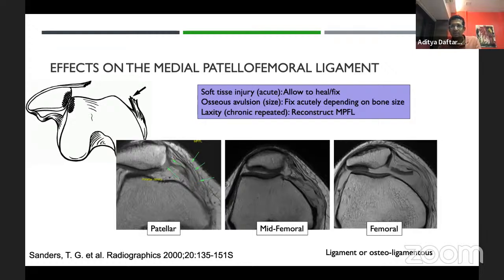In that case, you asked me about the quality of the tissue. I can give you something. But even if it's robust quality, if the person is dislocating repeatedly, you are going to reinforce it. So I don't even understand the entirety of this thing. The reason that I could give you that would be useful to understand about the MPFL is if I tell you that there's a bony avulsion that is sizable. Then I can tell you that, okay, this is the size of the avulsion. You can fix bone back rather than just doing something else back. See that.